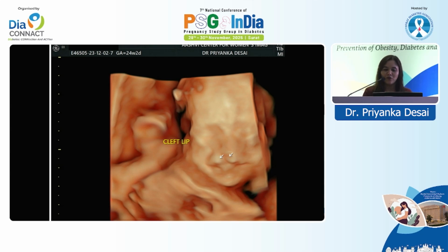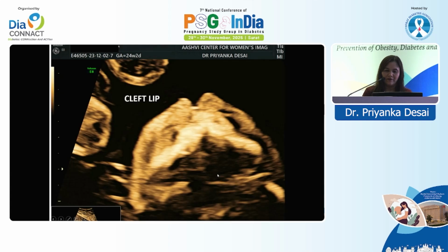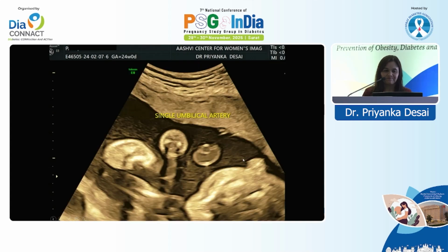Another patient, 24-weeker, type 2 diabetic again. So in the 3D image, we can see that there is a cleft of the lip. This is a cleft lip over here. This is a 2D image which is showing a break in the lip. So this is again a cleft lip. So another patient, 16-weeker, she's a type 1 diabetic, and here we can see that there is no left kidney seen. This is the right kidney over here, echogenic with the pelvis, and the left kidney was absent in this fetus.